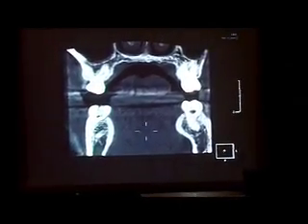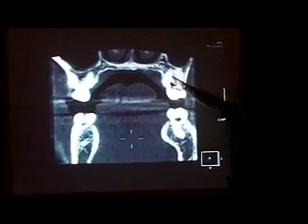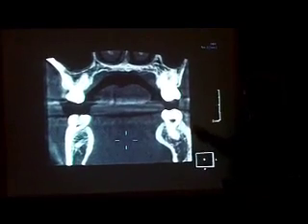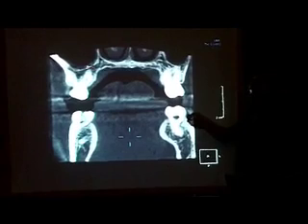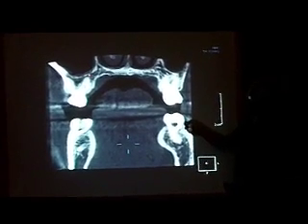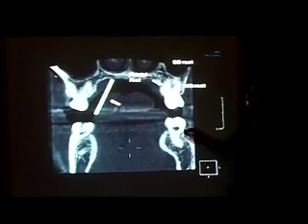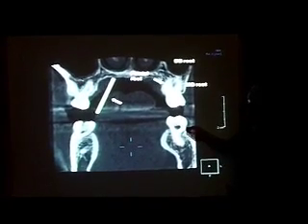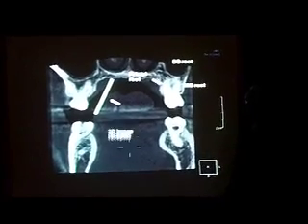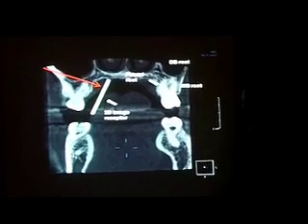Take this example — this is very rare — but in this one I can see the palatal root and the mesial buccal and distal buccal roots all in the same image; that very rarely happens. But think about a lesion. Do you really think, with an image receptor placed in here coming through the molar region — root, sinus, bone, root, more bone — that you could actually see something on the palatal apex with a 2D image receptor? You're not going to be able to. But when you can turn these images in all different directions, I can tell you precisely: this first molar has had endodontic treatment, that's the palatal root, this is the DB, and there's a big lesion on there. This is just one thin section out of a small volume machine.